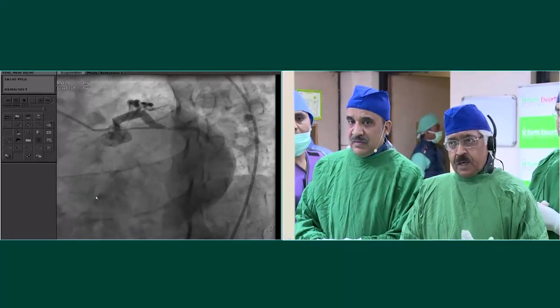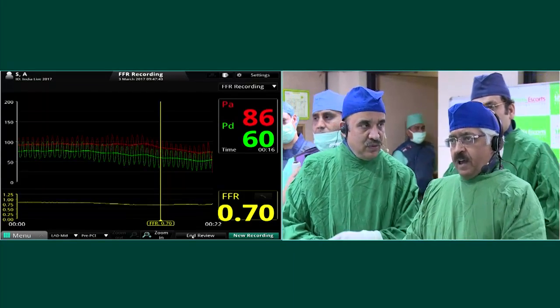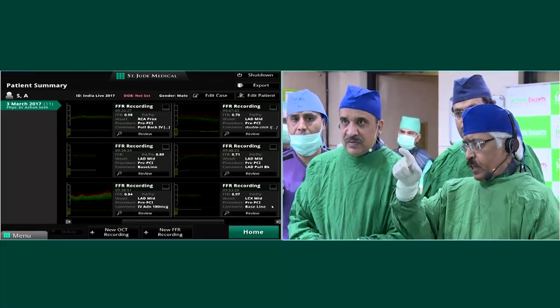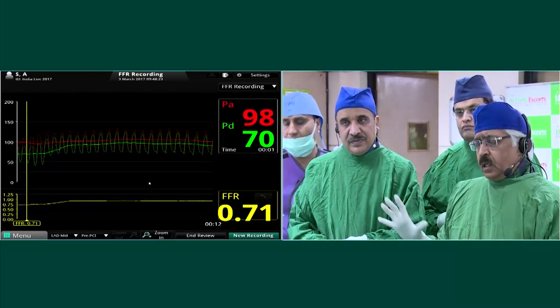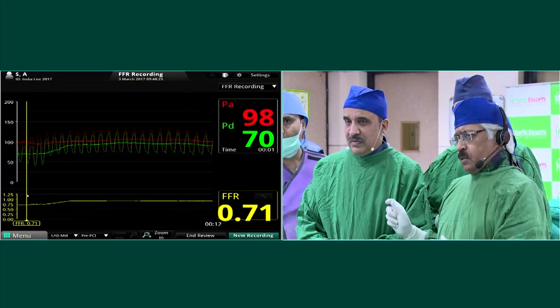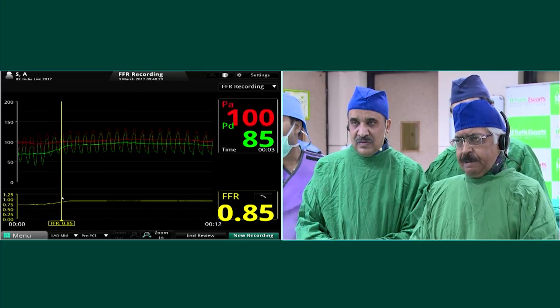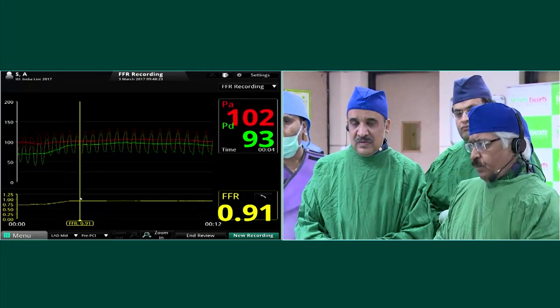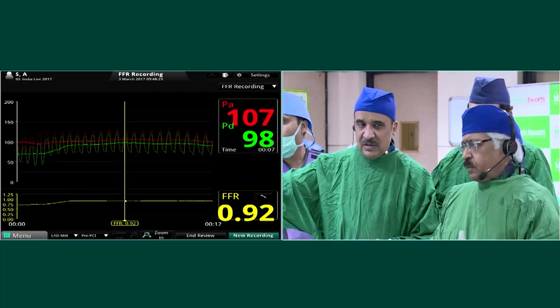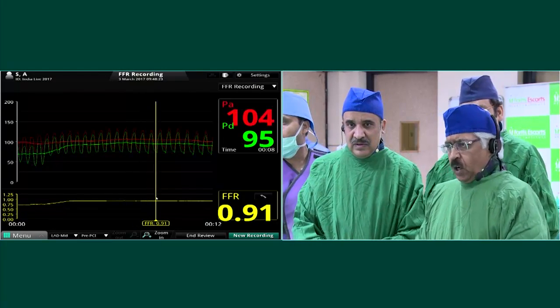Now the second aspect is, what I was very surprised by was the FFR on the circumflex. At the pullback, can we go to the LAD cranial view? The maximum gradient came across that tight point in the proximal LAD at the diagonal, and before that there was hardly any decrease. But anyway, the disease would have to be taken from the ostia itself, so that's not relevant.